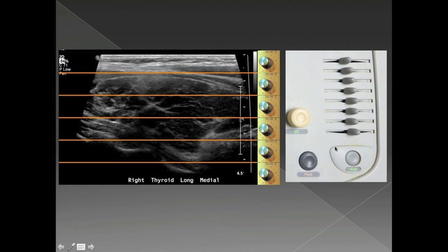What TGC does in the ultrasound machine is apply gain specifically to echoes that take a specific amount of time to return to the transducer. Echoes from the near field take a very short time, a little bit longer for the next zone, and so on. So you can selectively apply more or less gain to echoes returning from different depths within the tissue — that's time gain compensation, or TGC.